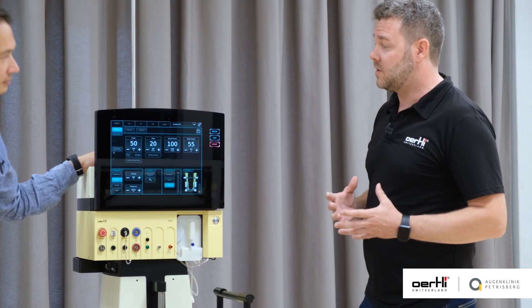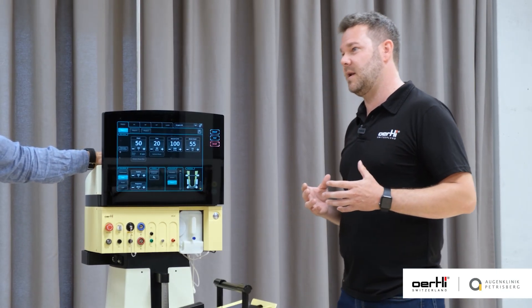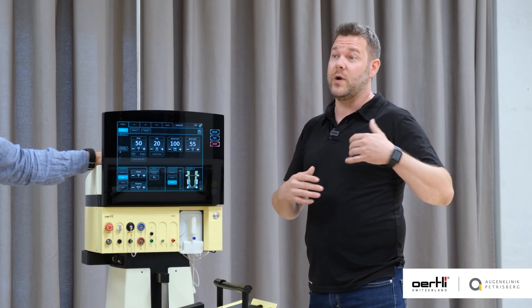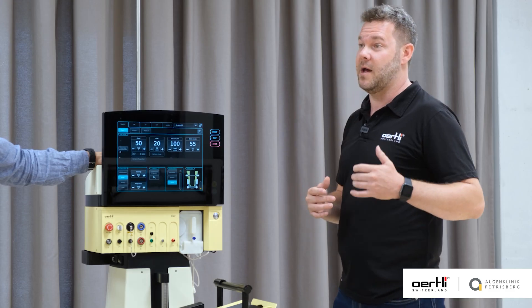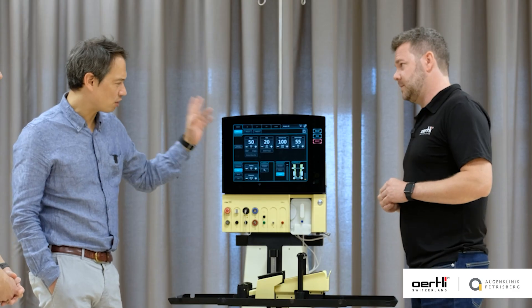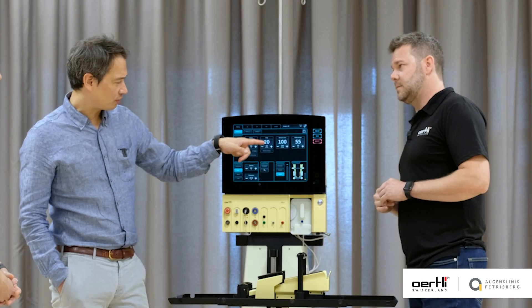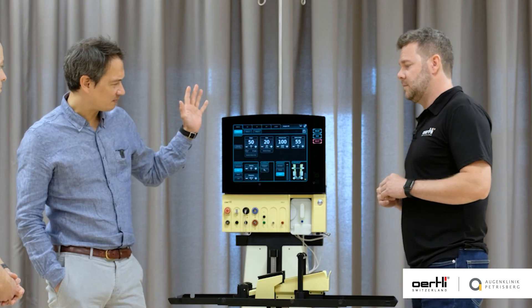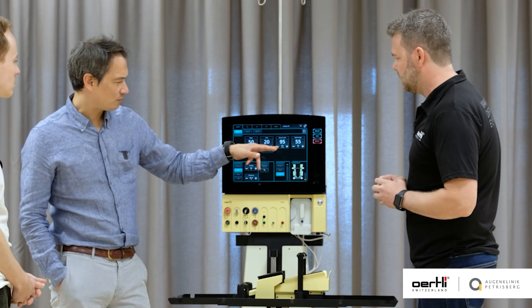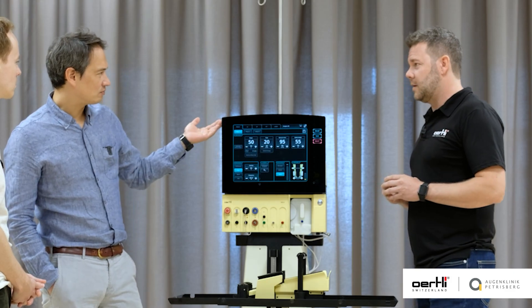Usually with the EasyFACO technology, the approach is that we use a little bit higher settings than the average in the market, because those things just make the fluidics and the physics work a little bit better for us. We have a very conservative FACO 1 mode for the groove — very low flow with 20, starting at 100 millimetres of mercury with the vacuum — that's what we use to groove.